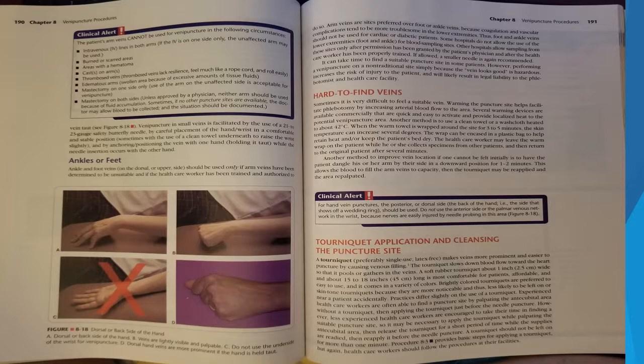Hands. Veins on the dorsal side of the hands or wrists, the back side, are acceptable venipuncture sites if the median, cubital, cephalic, and basilic veins are inaccessible on both arms. Veins in the wrists and ankles tend to move or roll aside as the needle is inserted. Therefore, it may be helpful to have the patient extend the hand or foot into a position that helps hold the vein taut.